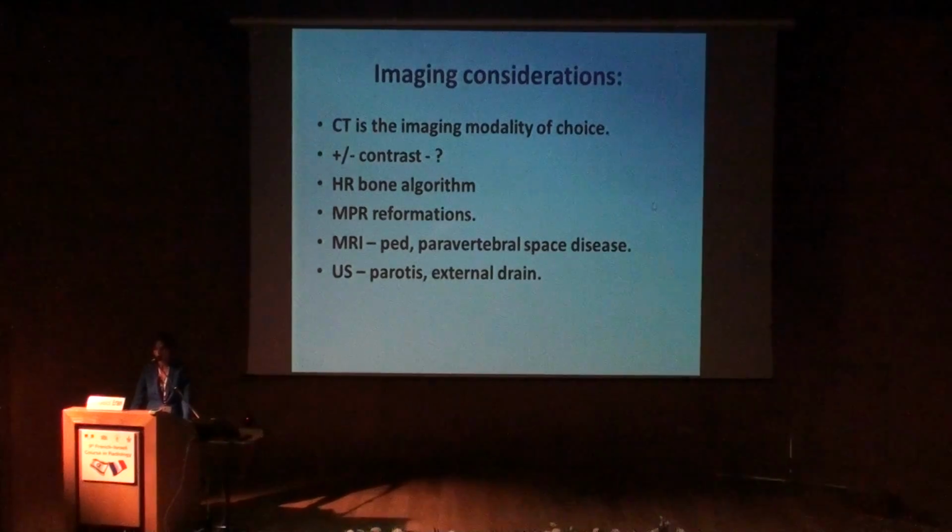So this is your choice, and also some of the patients might be critically ill, so you can scan them first fast in the CT. Whether to use or not to use contrast, well, you want to use contrast. The question is whether to also perform a non-contrasted study to look for calculi. If you don't suspect calculi, you can skip it. I think that most of the time you can even see the calculi with the contrasted study.